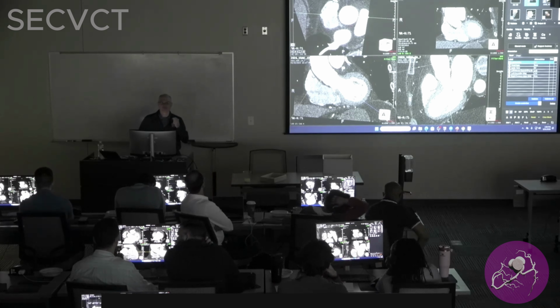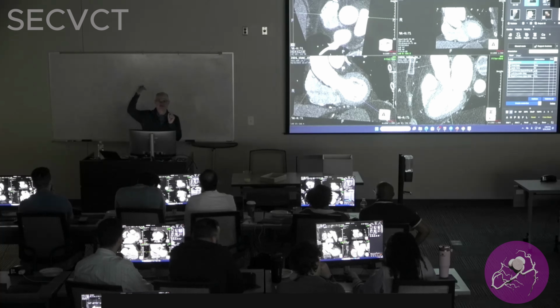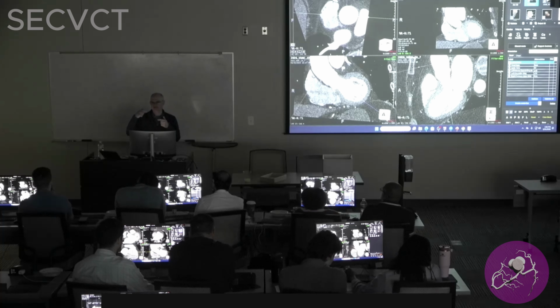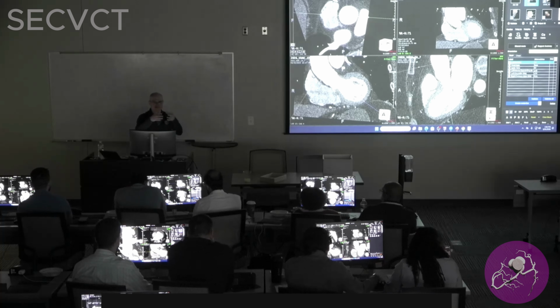Hold on a second. Let me just say what you said. The reason why the STJ is important is because you're going to be putting this introducer in, depending upon whether it's a balloon expandable, whether it's self-expanding. There are different constraints related to how bendable those deployment devices are, and you can end up with too much stuff or different angles in there.